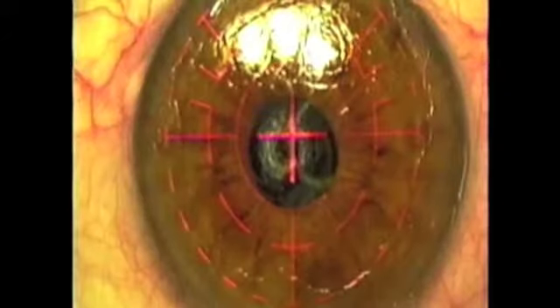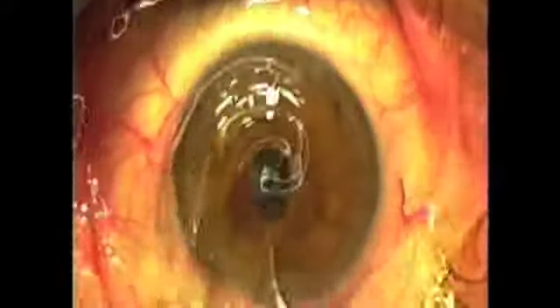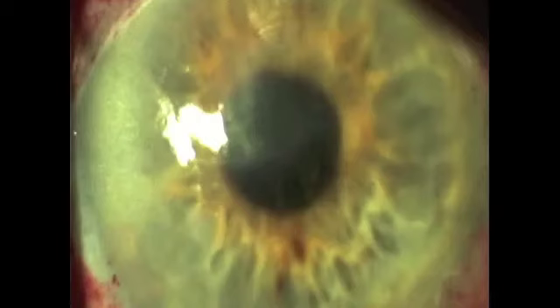As you can see here, this is then followed by laser PRK with mitomycin C and a bandage contact lens to tremendous visual outcomes. So no matter how bad the scar looks, let's use our algorithm to insist on taking patients straight to vision with the most elegance we can.